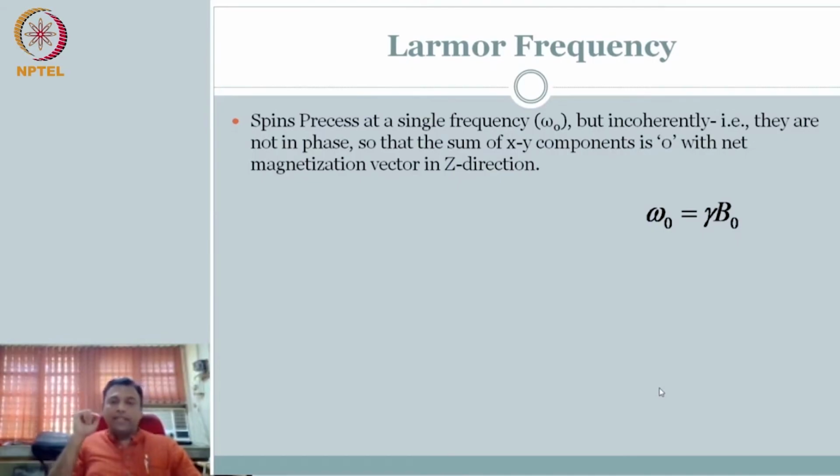So now notice carefully what has happened. Because of the external magnetic field that is applied, or in this analogy, I said everybody align yourself in the vertical direction, you have tried to come and you are spinning. And there is going to be net magnetization in this direction. But you are spinning around this direction at some frequency, which is called the Larmor frequency.